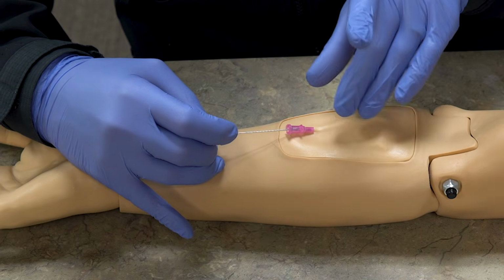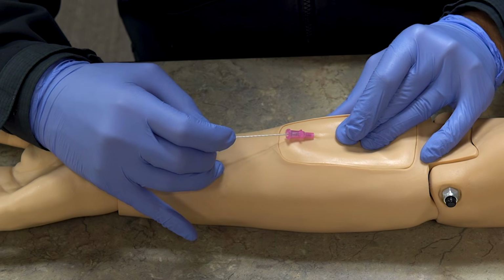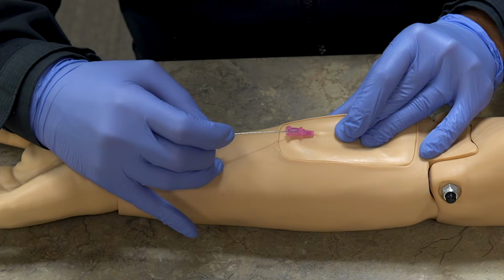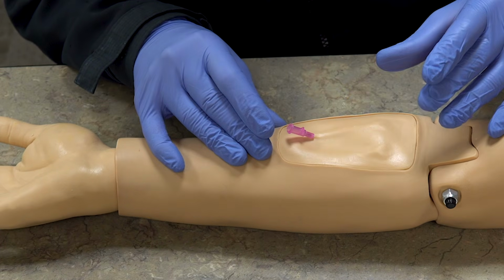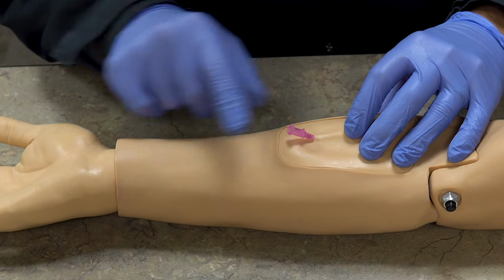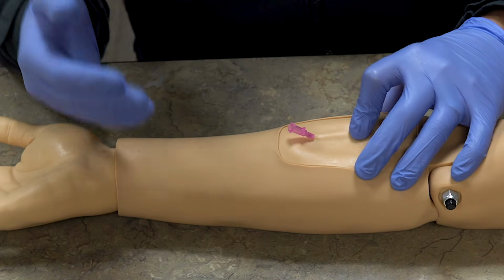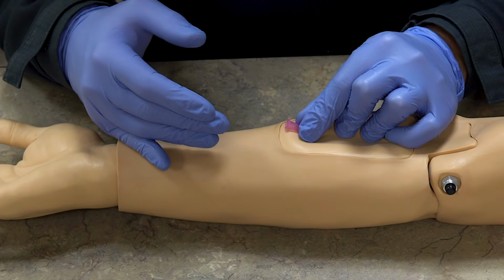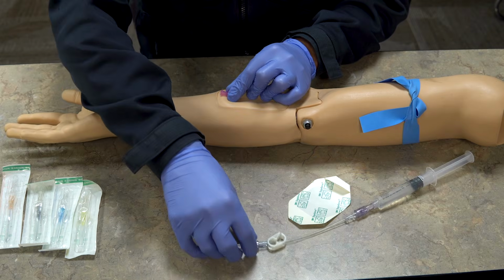Now as you remove it, I'm going to take my left hand and hold down on that vein an inch or so away from that catheter, and that's going to hold that vein closed so that blood doesn't start coming up here, because if I let that go on a normal patient, they'd start bleeding out of that catheter, and it's a mess, and the more blood you have, the more chance of infection. It's not the end of the world if that happens. You can try to hold that catheter down, just don't let that fall out and don't let the patient move.